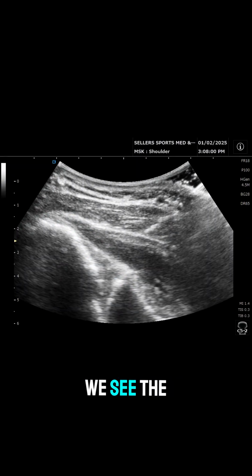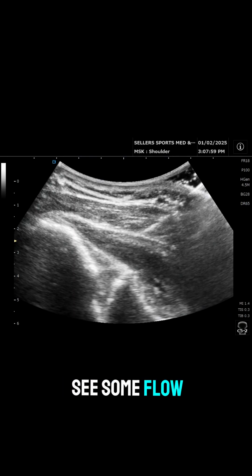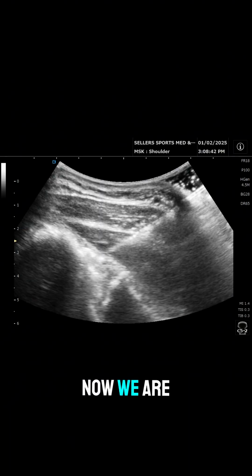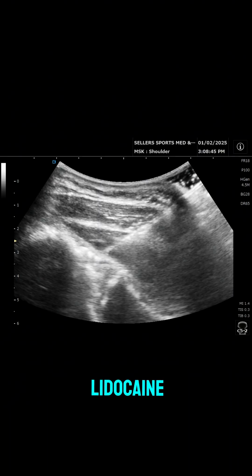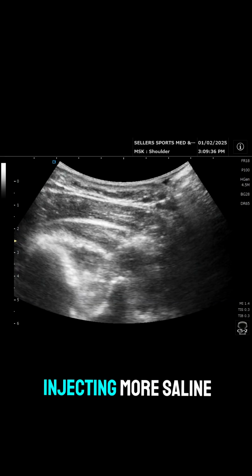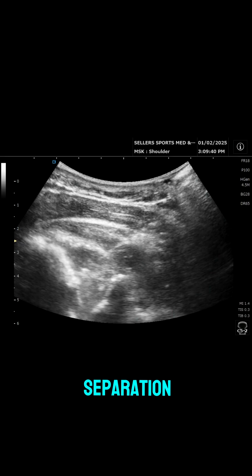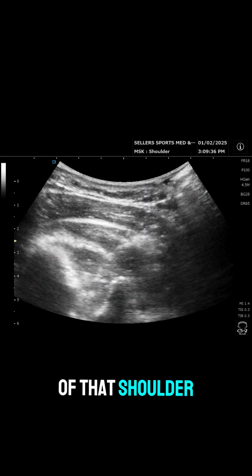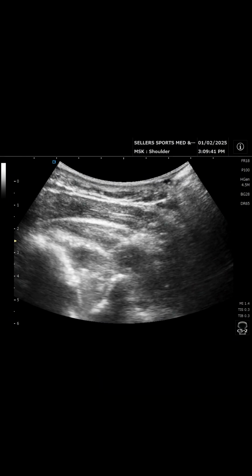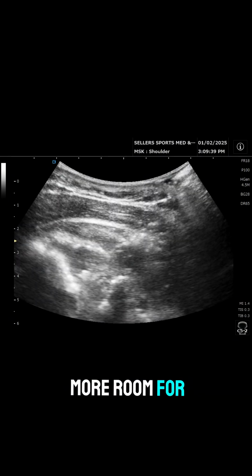We see the needle in the joint space injecting some lidocaine. You can actually see some flow of that injectate in the joint space. Now we are injecting saline with lidocaine with a sizable force into that joint space. Now we are injecting more saline into that joint space, and we're really seeing a big separation of that shoulder joint capsule away from that humeral head, which is, you can see that fluid in that joint space, giving a lot more room for that joint to move.